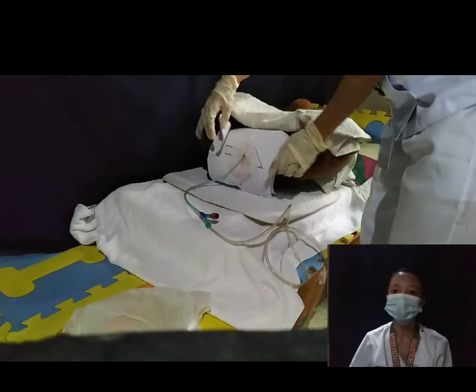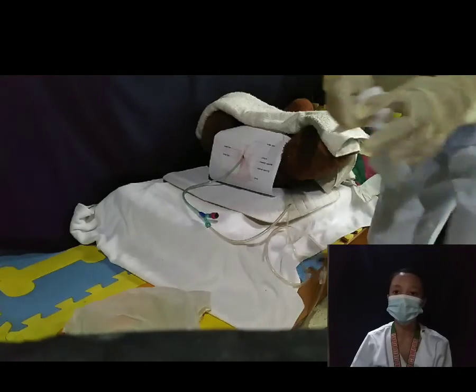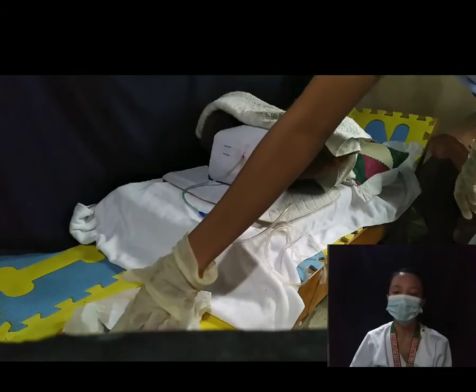Then after assuring all the procedure is okay, we're now going to dispose of all the materials that we have used. Then after proper disposal and removal of gloves, we will be assisting our patient to a comfortable position. After that, we will document the catheter procedure, which includes the date and time, the catheter size, the client's reaction, the characteristics, and the amount of urine.